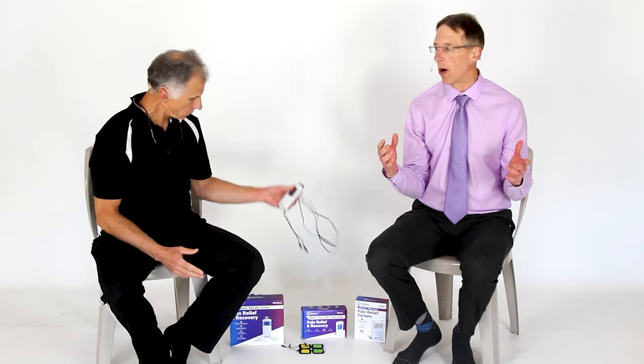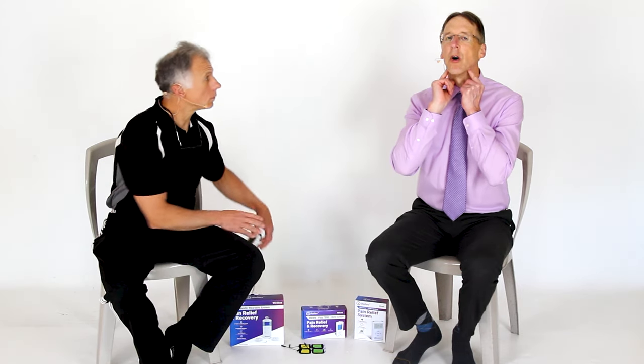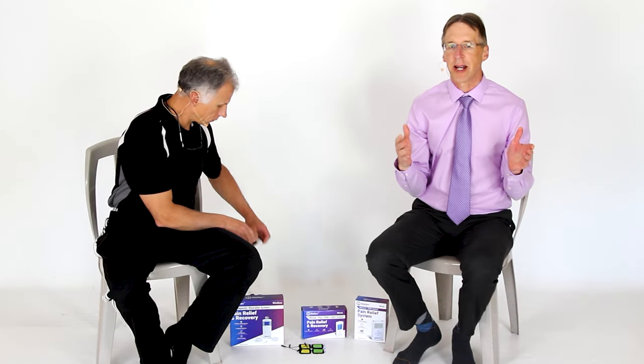If you have a different TENS unit, that's fine — just use their instructions. We can't give instructions for every TENS unit out there, but the pad placement we're talking about today can be used with any TENS unit; it's the same. One big precaution: we don't want you putting pads over the carotid arteries. That can mess up your sinus rhythm and your heart rate — not a desirable thing.